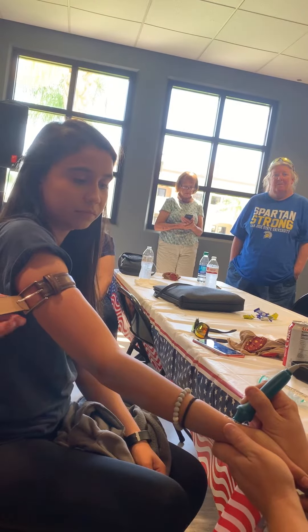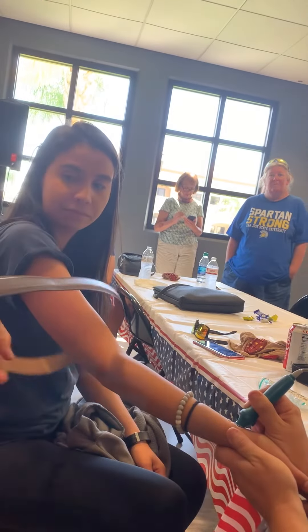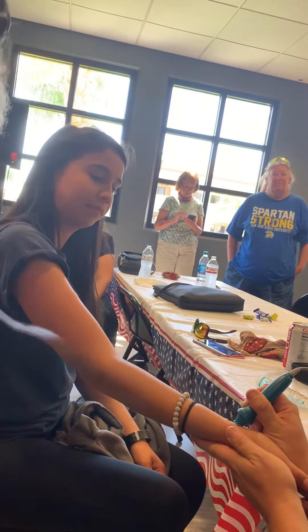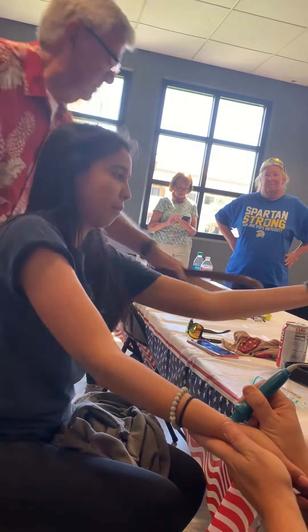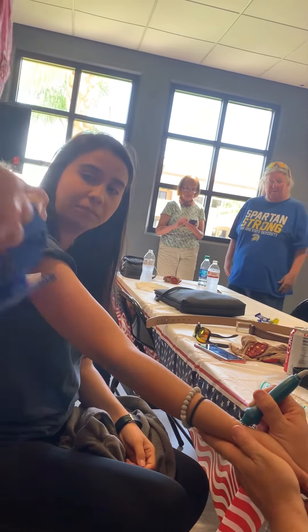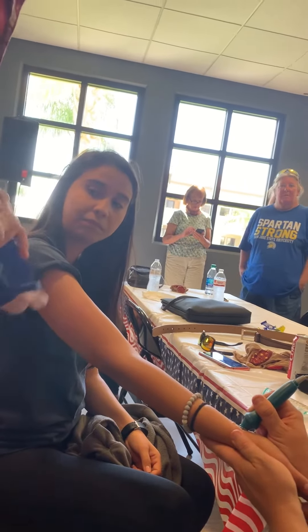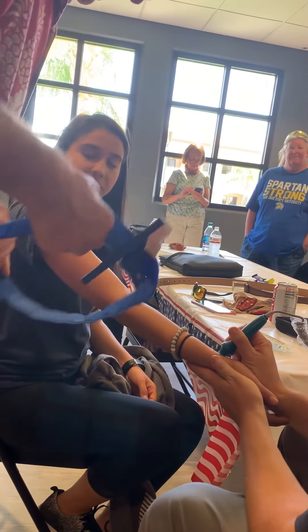Take that off and put the tourniquet on. So you've never been trained on a tourniquet — without any training, you've never seen this. The concept of this tourniquet is that it has a windlass, so you pull the whole strap out — I'm holding your hand — pull all of it out.